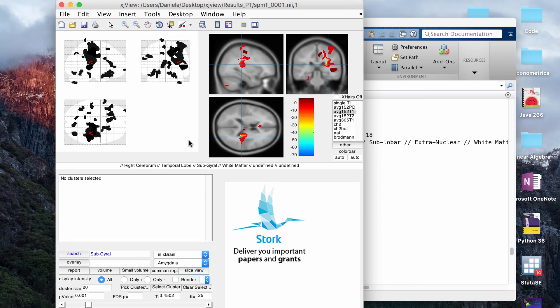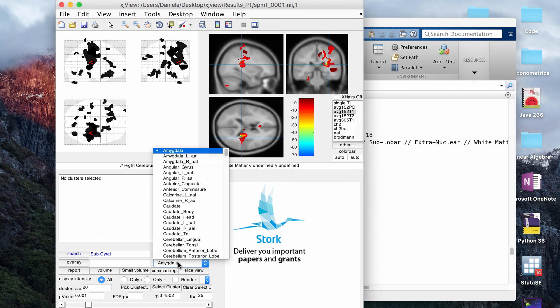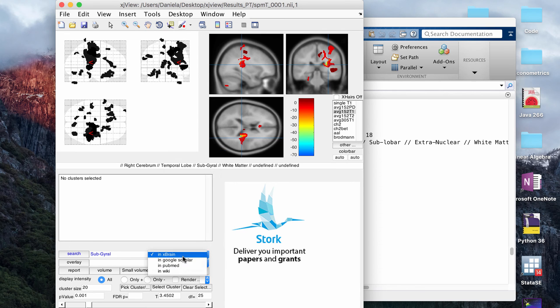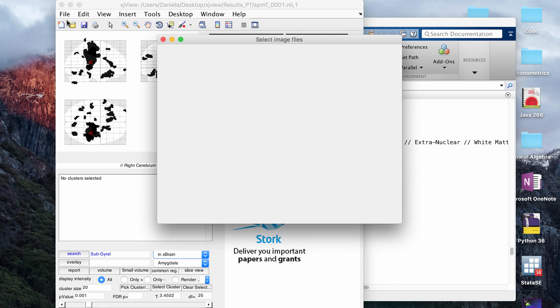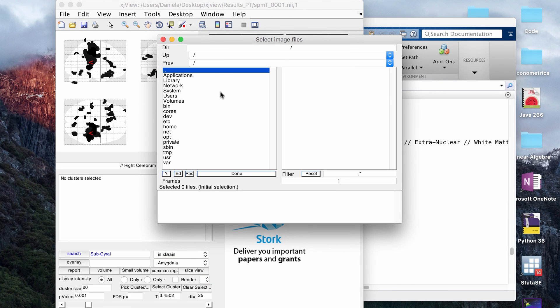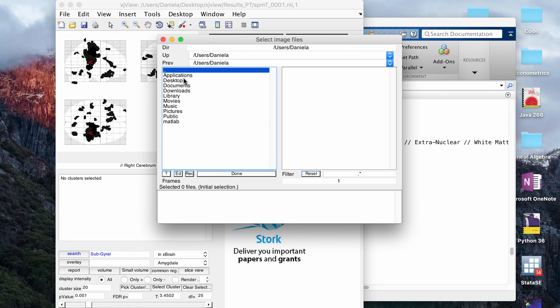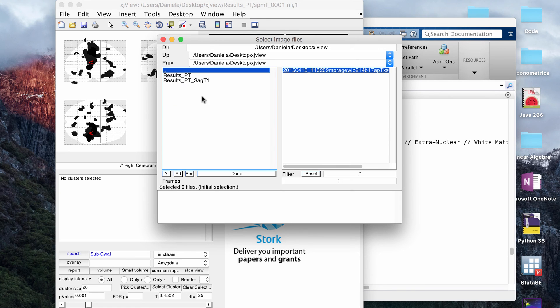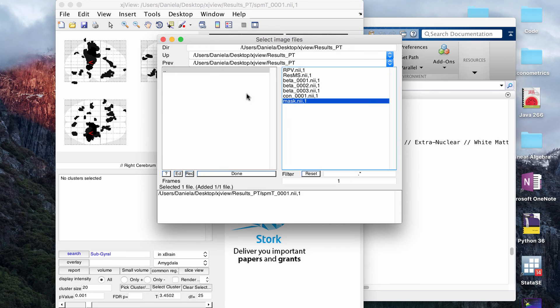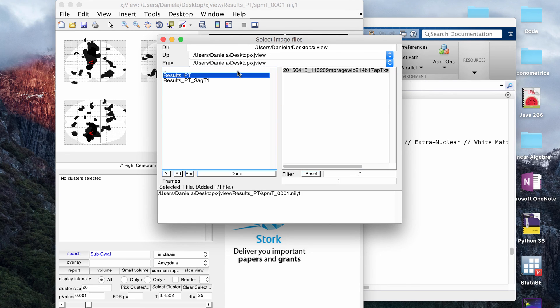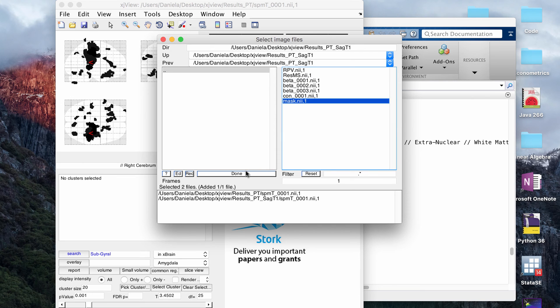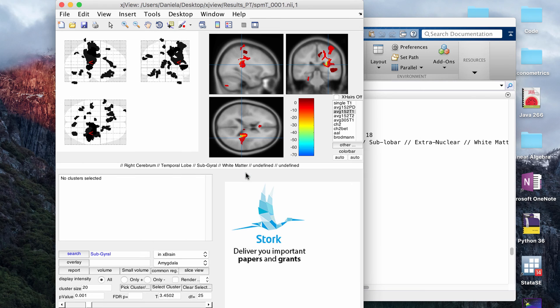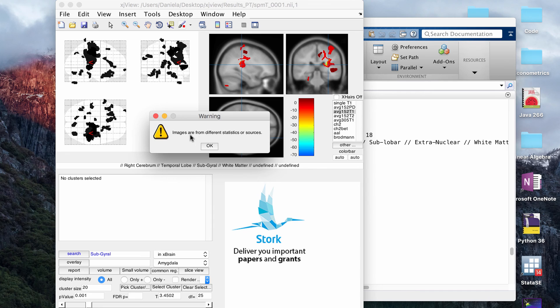Let me see what else do I want to talk about. I don't really use these buttons, but it lets you search through anatomy and a couple different programs. Another thing I want to talk about is if you have overlays. For example, for this patient, we did a 3T scan and a 7T scan. I did VBM for both of those studies, and then I want to compare are the clusters somewhat the same or which clusters are overlapping on the two studies. I went to open file. I'm going to click two TMAP images and then click done, and it's going to show me an overlay of the two.